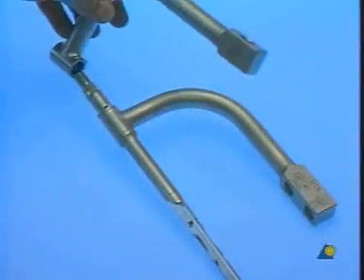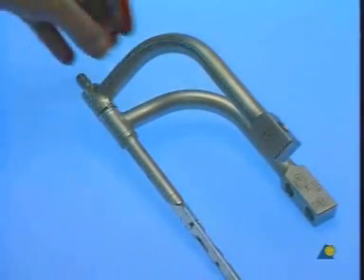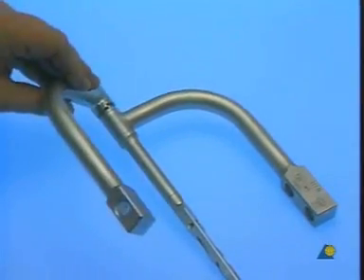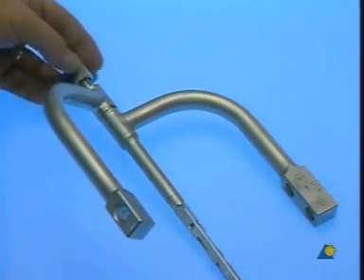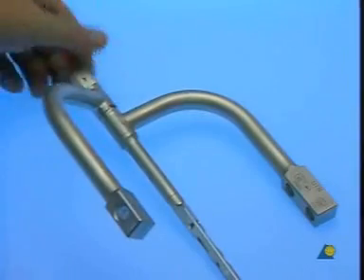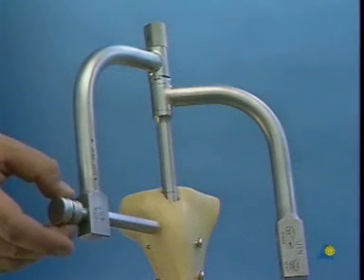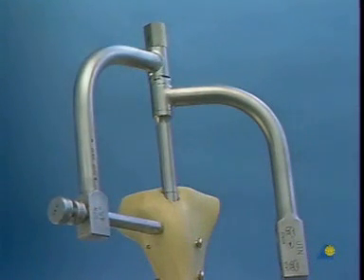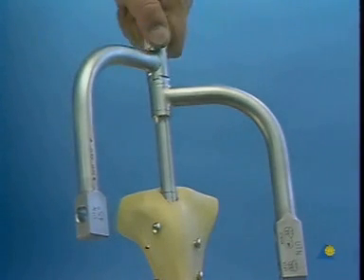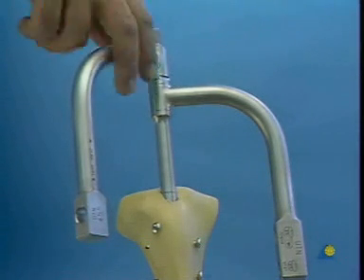The 45-degree insertion handle is used to position the diagonal bolt. This handle may be positioned medially or laterally according to the desired position of the bolt, and is held in the correct position by a knurled nut. Actual insertion of the locking bolt is carried out in relation to the medial-lateral bolt. Once locking has been completed, the 45-degree insertion handle and the insertion assembly are removed.